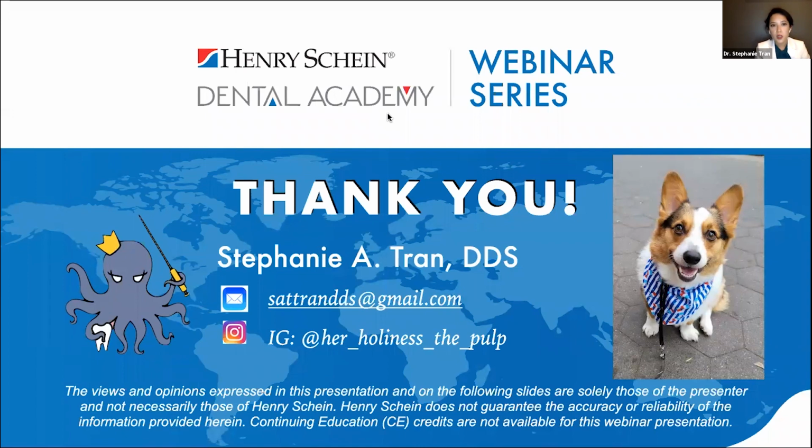For endo, we use the powder a lot to soak up really purulent, draining teeth, or if I want a really firm pack for vital pulp therapy, where you'd want a thicker pack. But as a restorative dentist, or just in general, use the liquid form. They have a lot of options. Just don't express it too hard, because if it goes into vital structures, that's really bad. Your second question, how to remove it: irrigate it out with hypochlorite.